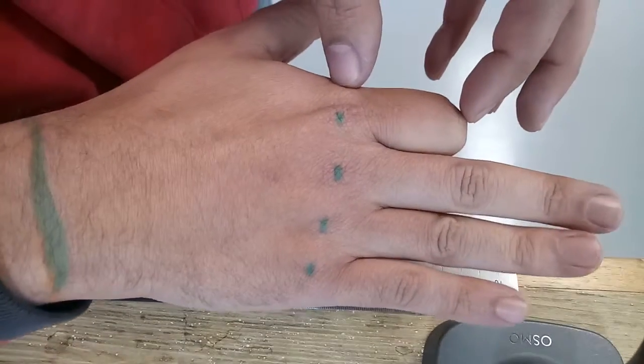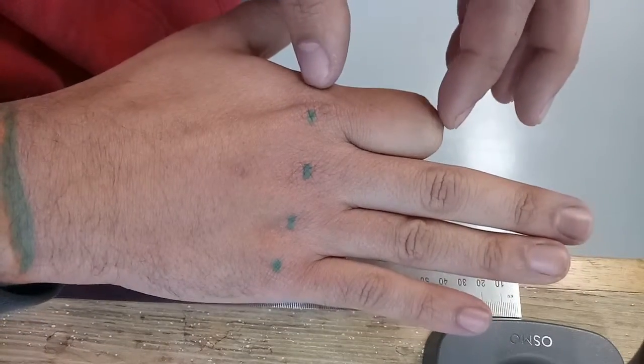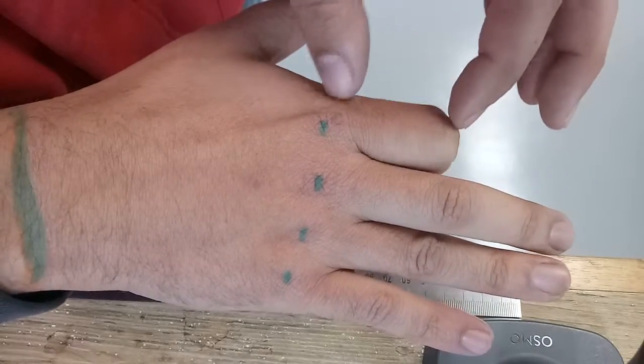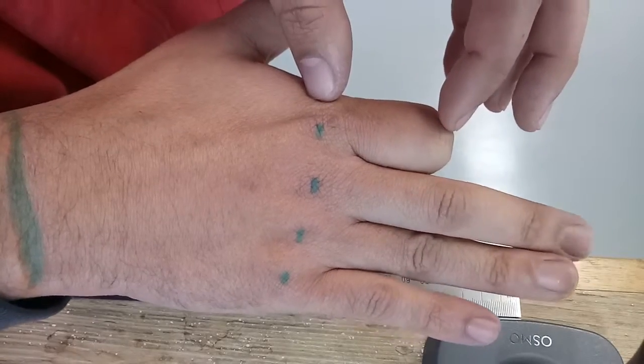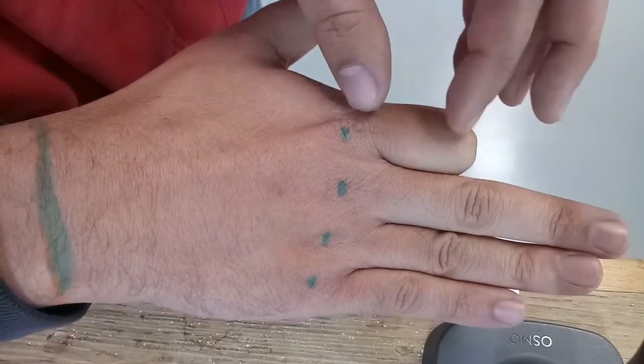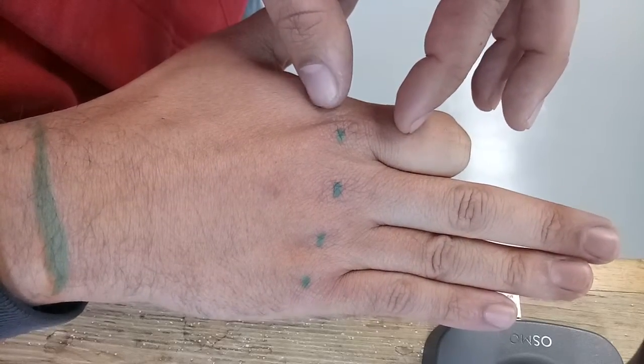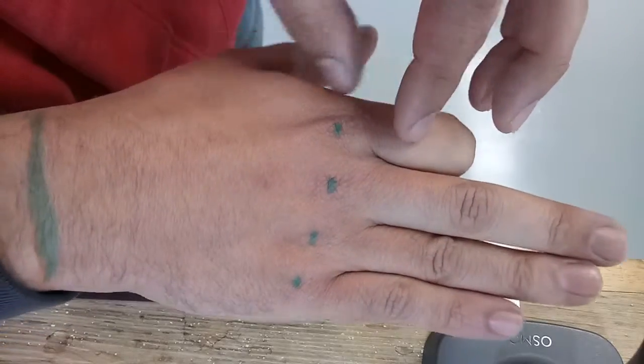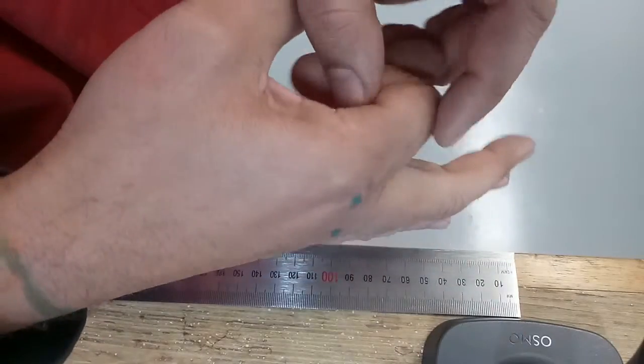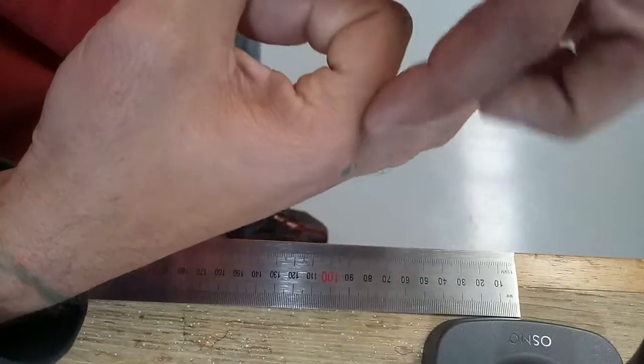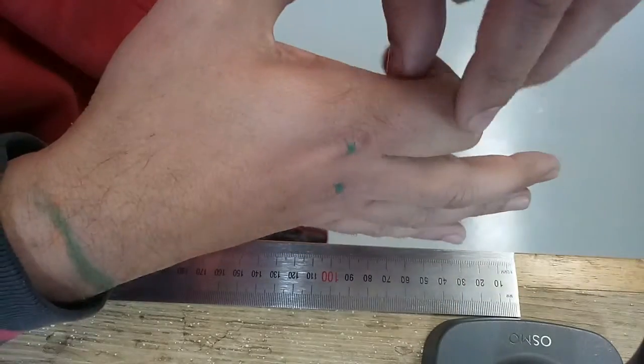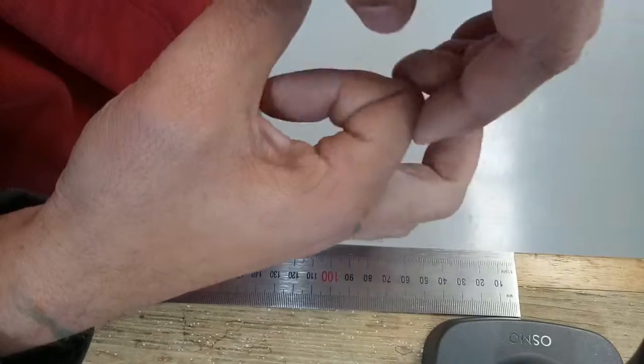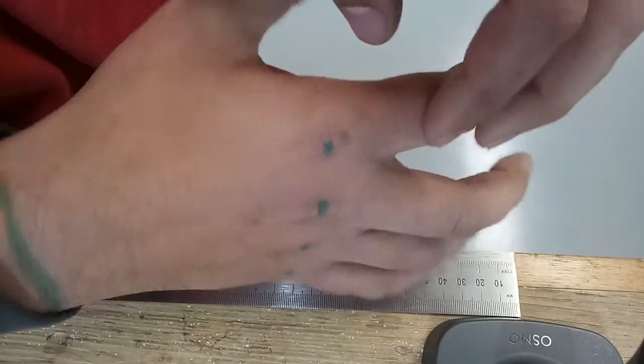For the design of the kinetic finger it does require a finger stub below this first knuckle, and in some cases if the stub is too short it won't function. We need some sort of good length in here to be able to get leverage on the finger to then allow the kinetic finger to open and close.